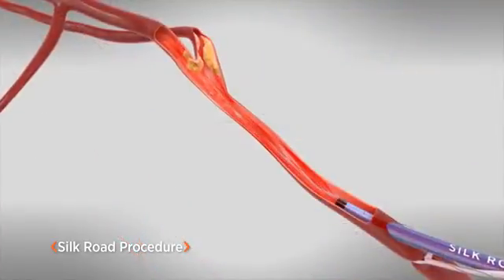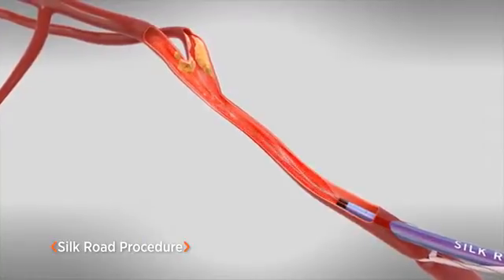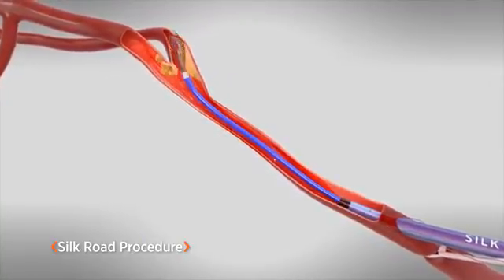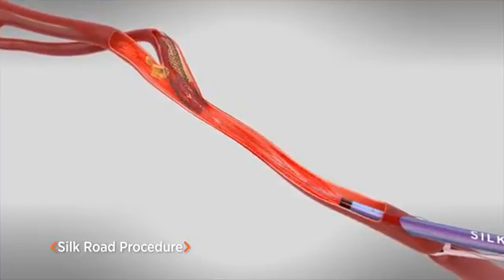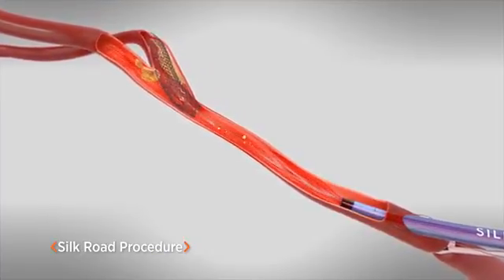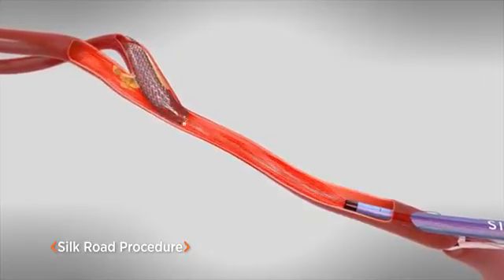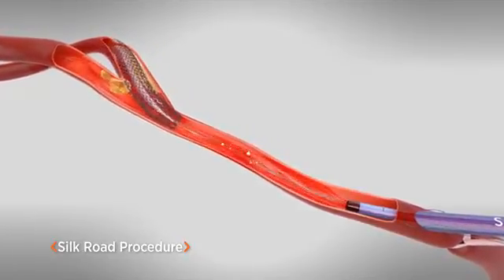The lesion is treated with a stent while blood flow is reversed, and the brain is protected from the disease in the artery. Treating the lesion and expanding a stent may disrupt the plaque, causing dangerous debris to come loose. If a balloon is used to dilate the stent, additional debris may be released.